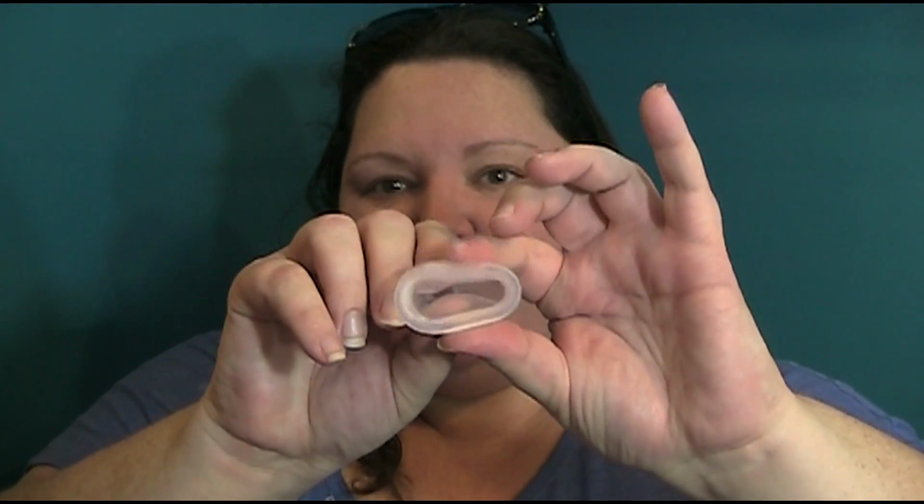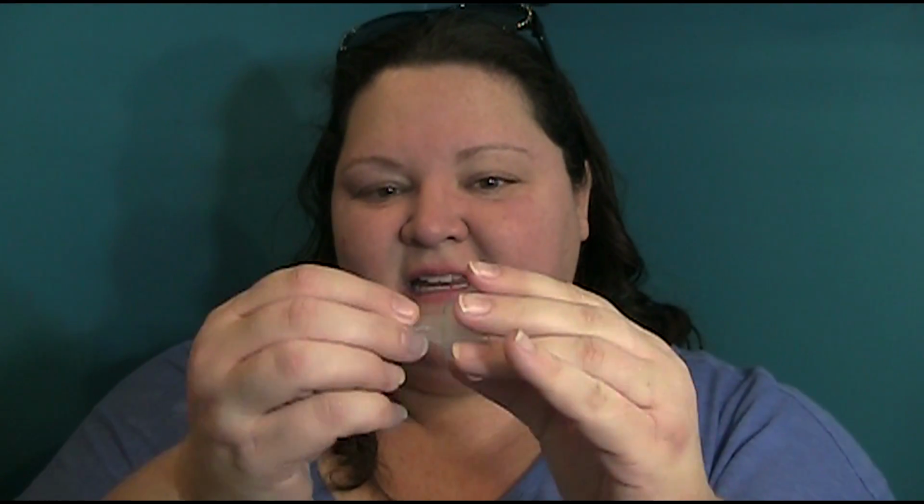Any wetness you see in here is because I washed it so I could show it to you. This is not any bodily fluids in here. But this is what the cervical cap looks like. It's folded up like this inside the condom, so it's flat in the condom. It's not hurting you as you would be having sex. It's very squishy. The rim is nice and firm like a menstrual cup would be, but the rest of it is very, very, very soft. So that's nice, but it is also quite sturdy.